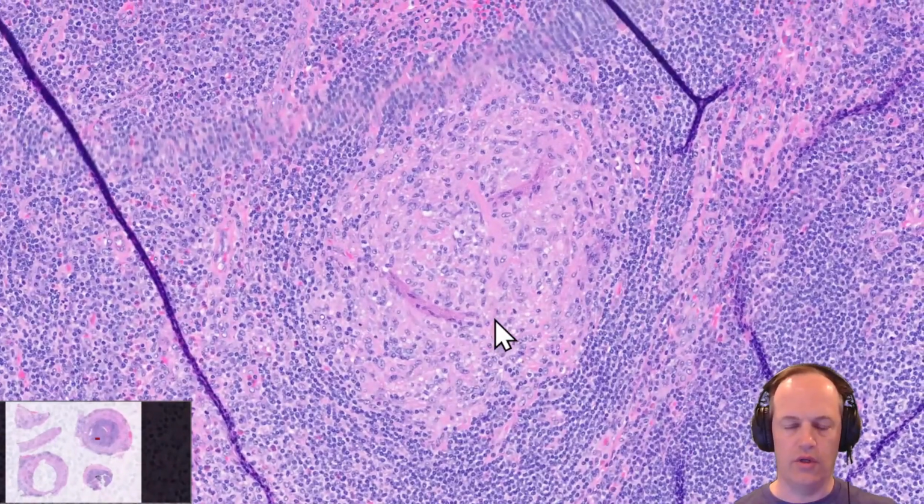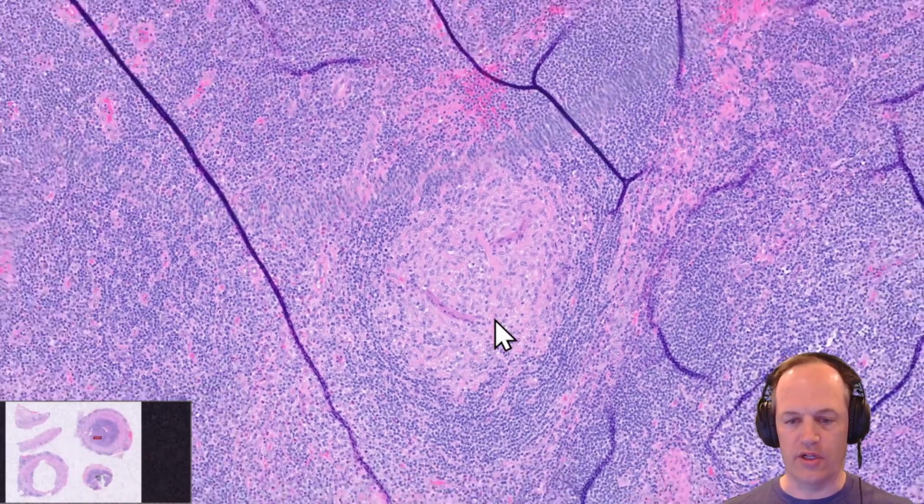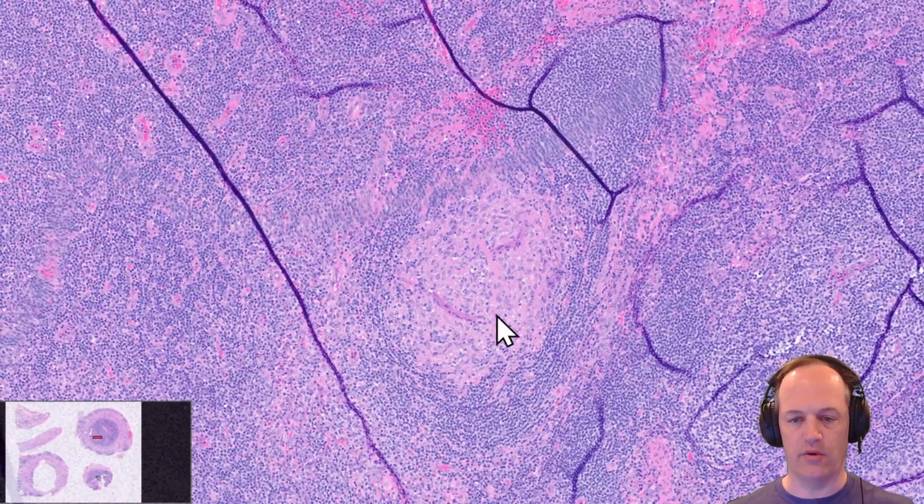If you are studying for an exam and you're looking at buzzwords, you might see something like Yersinia, right? This is something that could be associated with rare infections, but actually more often, this could be a manifestation of Crohn's disease. It could also be chronic granulomatous disease. These are non-caseating granulomas.